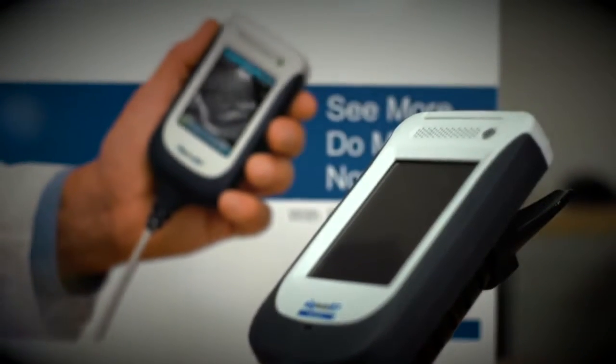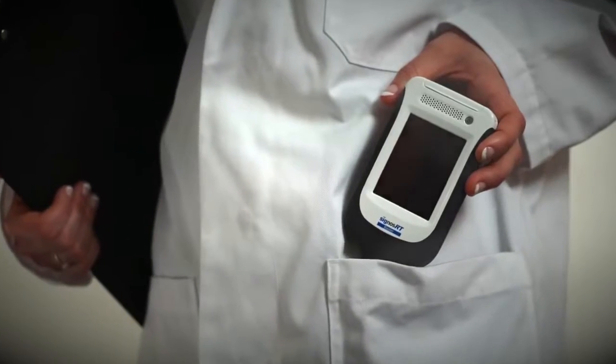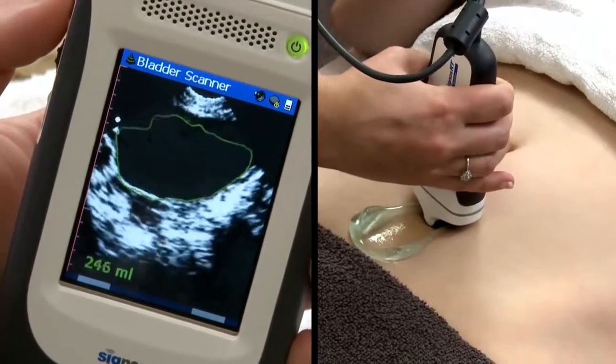The SignosRT Bladder Scanner, developed and made in Australia, automatically detects the bladder and calculates bladder volume utilizing ultrasound technology. It is wonderfully portable, reliable, quick and easy to use.